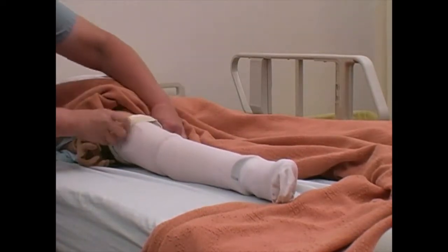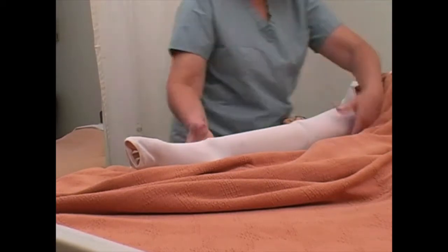Release the stocking gently. Do not snap. Ensure the stocking is smooth and wrinkle-free.